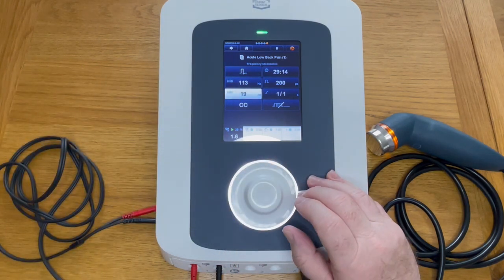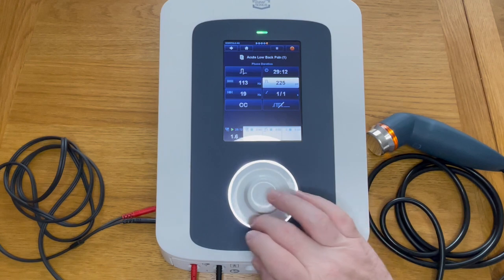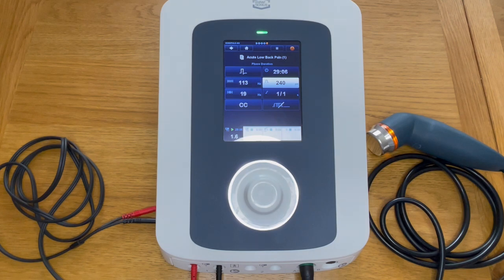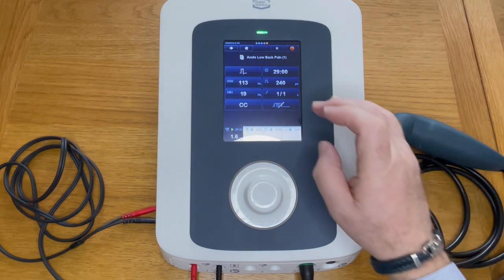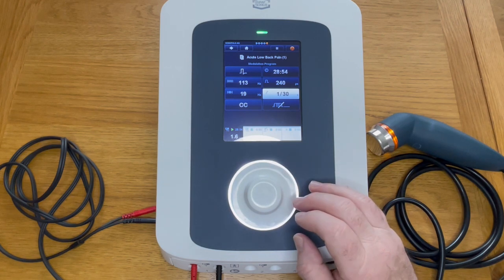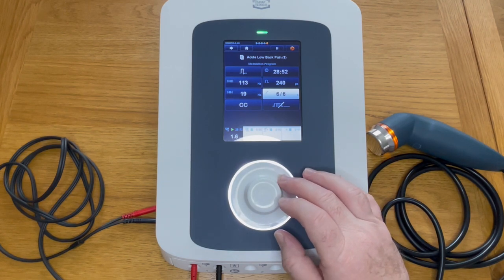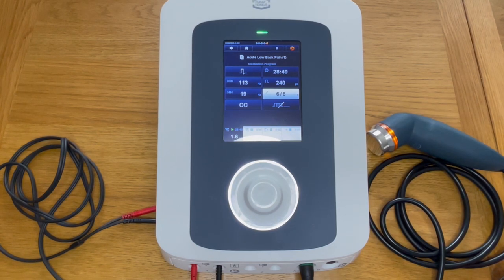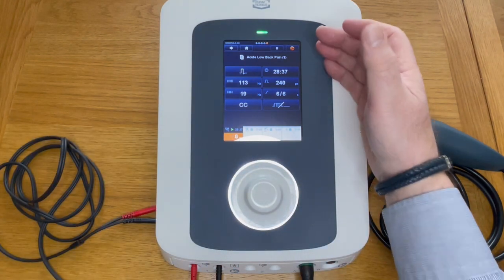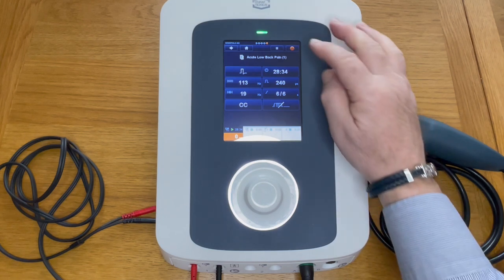If you need to change any of the pulse widths or pulse frequencies, you can see current is still being applied and you can still change these. It's advisable to let the patient know you're changing them as they may feel a change in the current. The rise and fall time can be changed from one second, six seconds, twelve seconds, up to thirty seconds — most commonly six to six, which is the most comfortable rise and fall time between the beat frequencies of your carrier frequency.